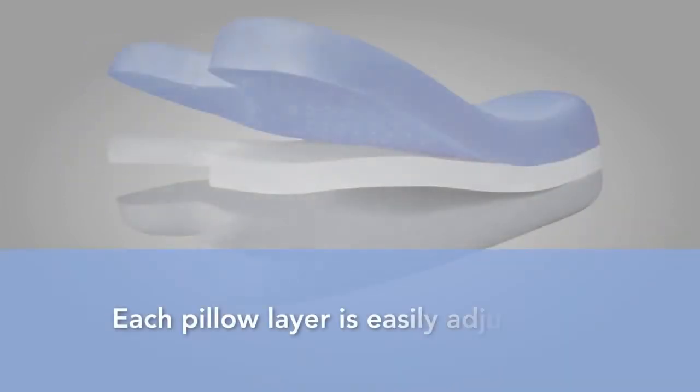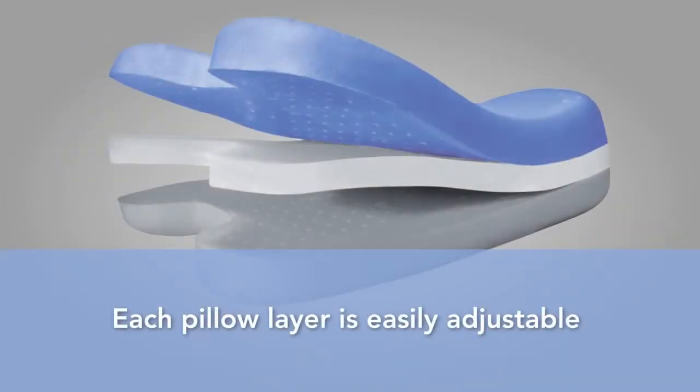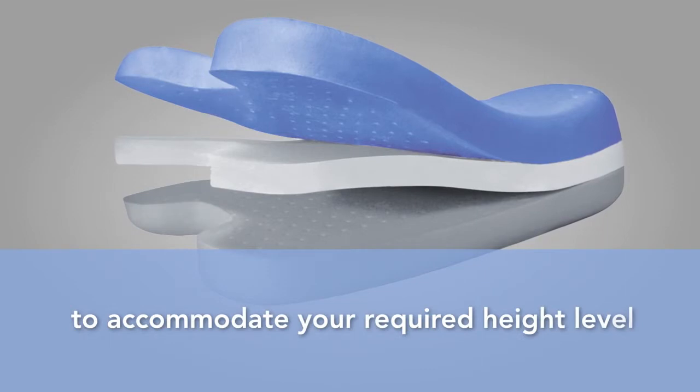Each pillow layer is easily adjustable to accommodate your required height level.